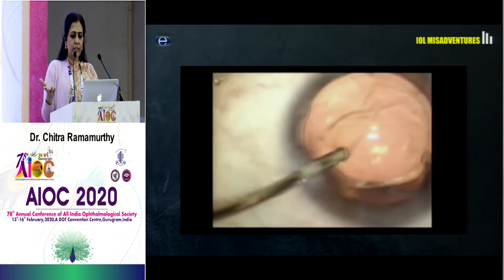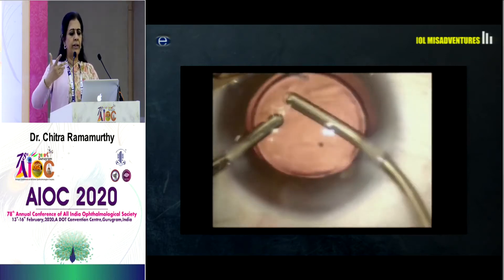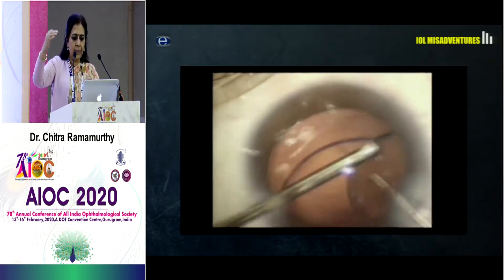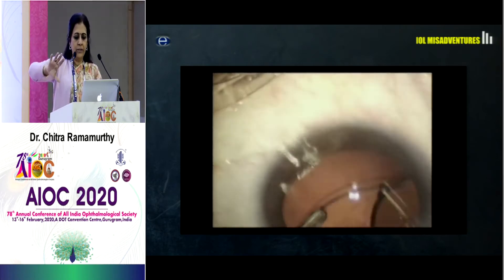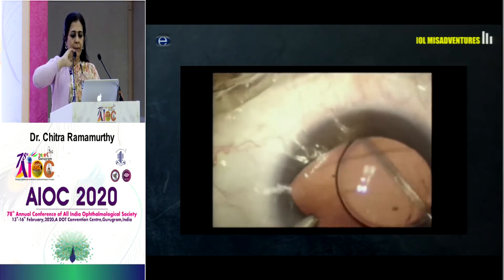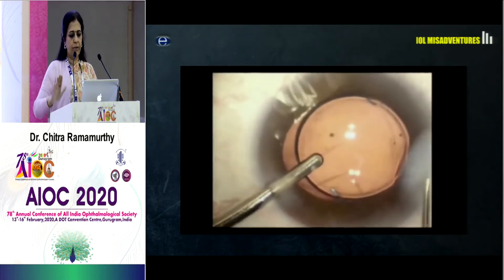With great confidence, a three-piece IOL is injected into the bag. It's centered, everything is all right, and then I start removing the viscoelastic in front and behind with absolute jubilance, absolutely confident that I have dealt with this. The cornea is clear, but look — the haptic is sinking and the whole nucleus is sort of going into the vitreous. Then it all becomes jugglery and I have to get my piece up, somehow manage to get my haptic onto the sulcus and take a heavy, relieved breath.